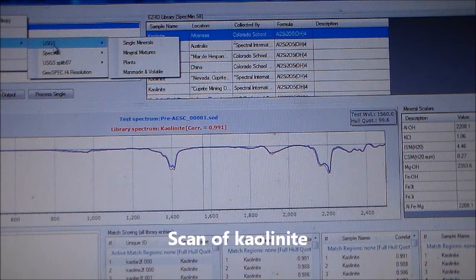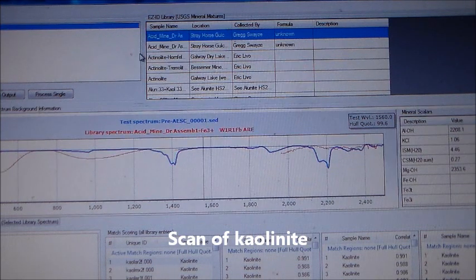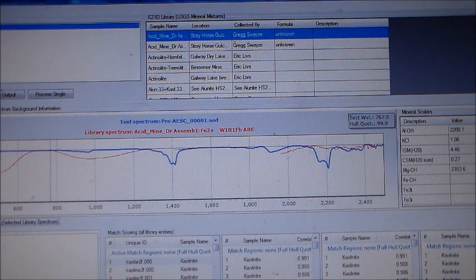This is a scan of kaolinite, a clay. The samples of kaolinite from the different libraries are slightly different — different locations — but all have the same basic chemical composition.